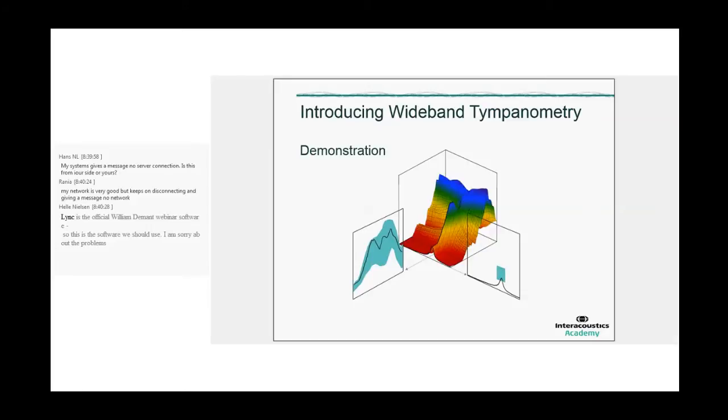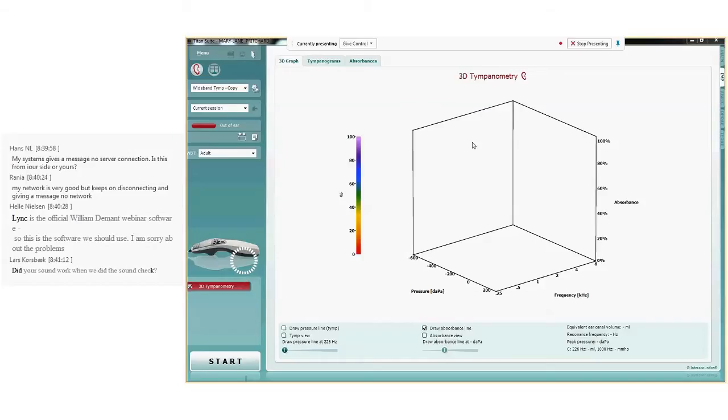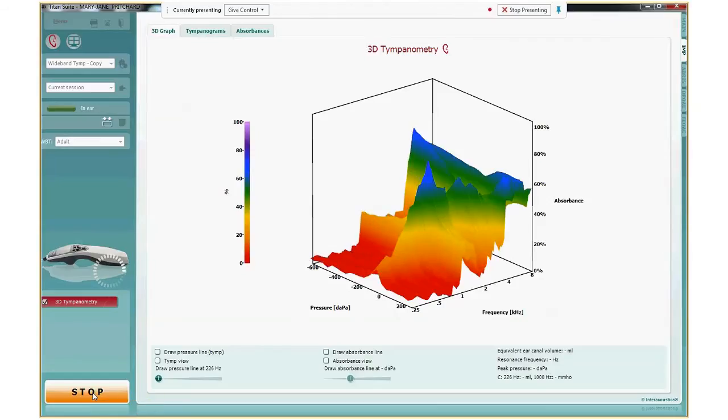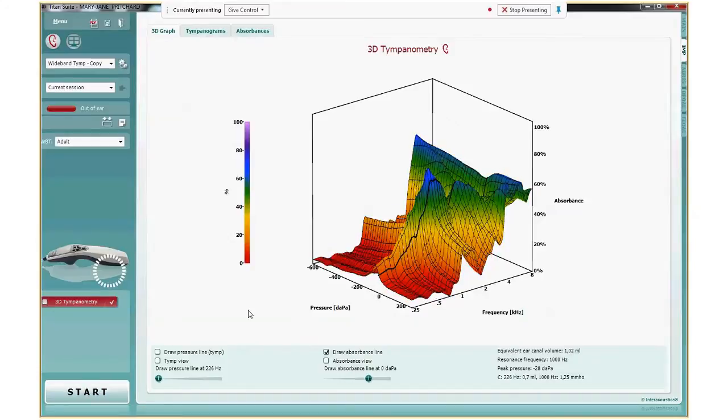So let's look at the real measurement. I now need to switch to my monitor. Now I need to find the probe of my Titan and put it in my ear. The probe is now going in my ear. We can see the status became in ear. I will now press the start button in the software. And of course I had to be quiet during the measurement.